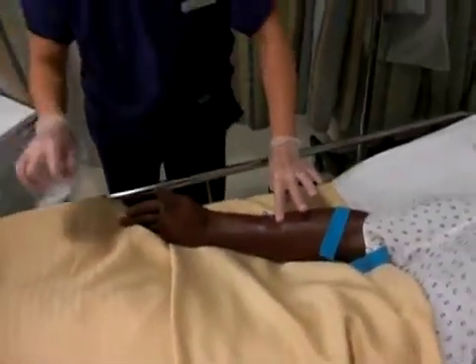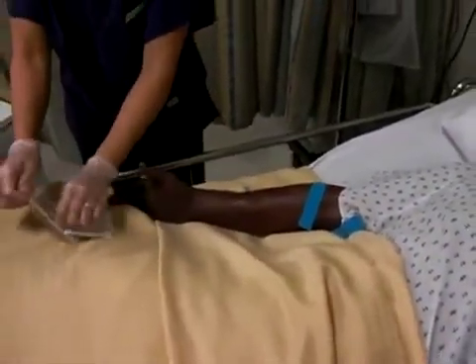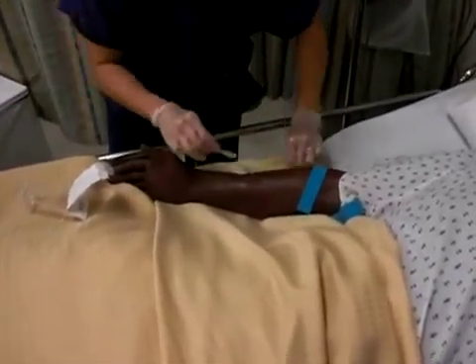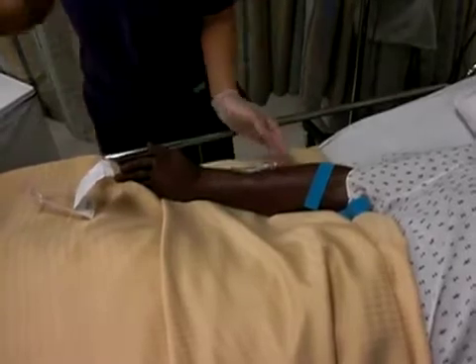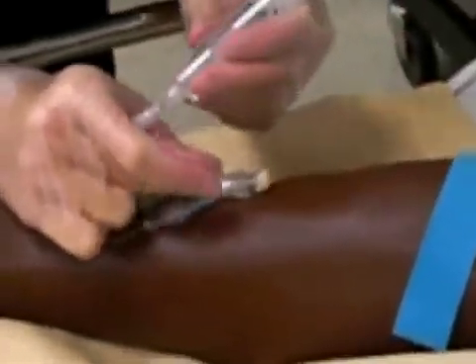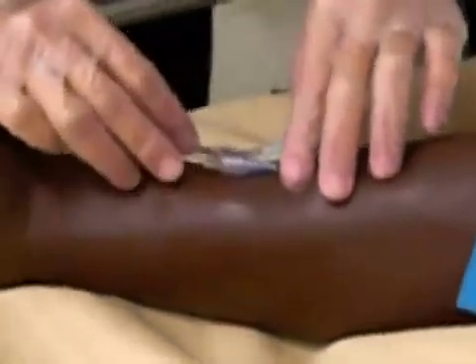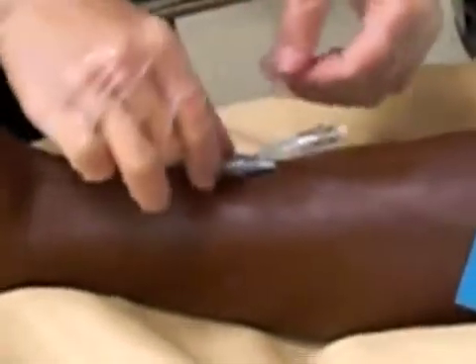The nurse connects the saline lock to the end of the cannula, then flushes the injection cap with normal saline to check for patency. The cannula is now secured by placing a narrow piece of tape under the cannula hub with sticky side up and cross tape over the catheter hub to make a chevron.